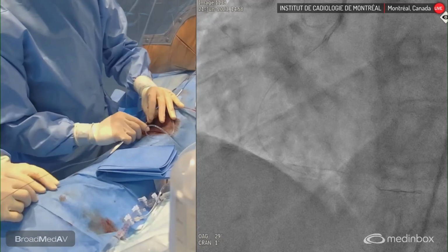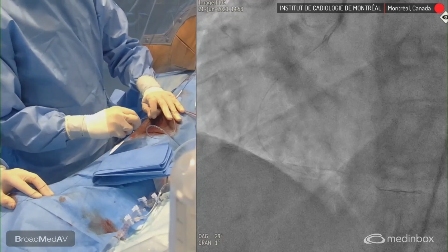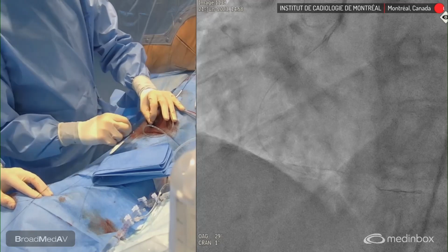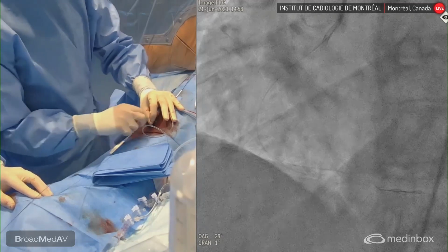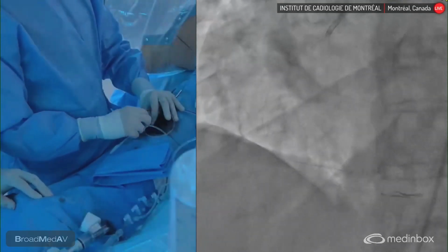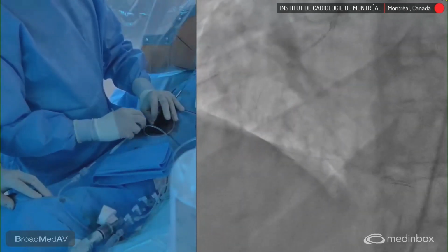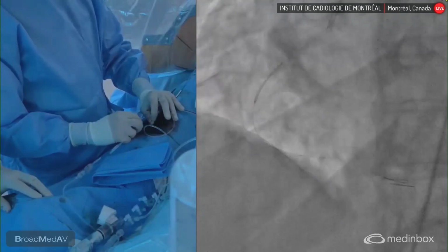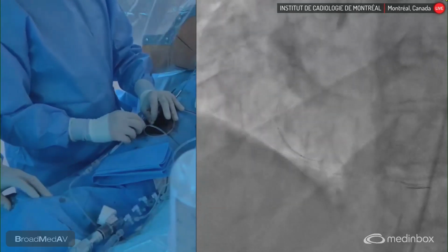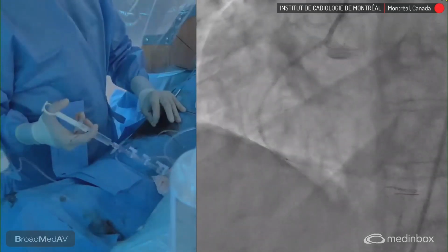So there are some questions on the screen. Which stents are recommended for CTOs in recent guidelines? I believe this refers to stent type. Of course, we always use drug-eluting stents. Which one particularly is useful? It's fairly easy. Any kind of standard usual stent will do for us. Mohammed, do you have any comments with that? I think you should not use BVS, you should not use BMS. That's clear.